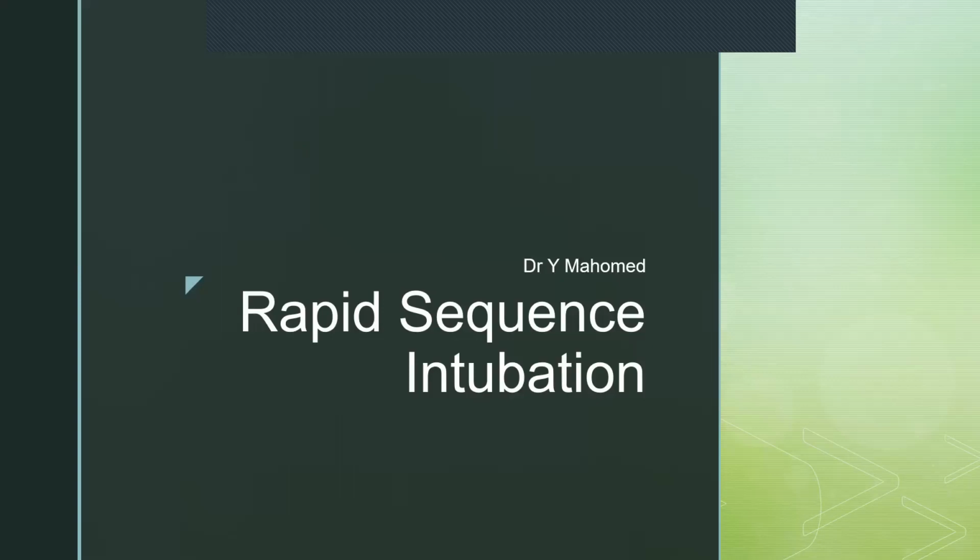Now, all the things that I'm going to show you are basically going to happen concurrently. So it's not that you get the drugs ready, then you position the patient, then you pre-oxygenate the patient, for example. You are going to do all of these things at exactly the same time. That's what RSI, rapid sequence intubation, is.